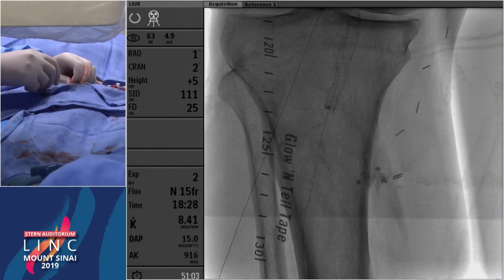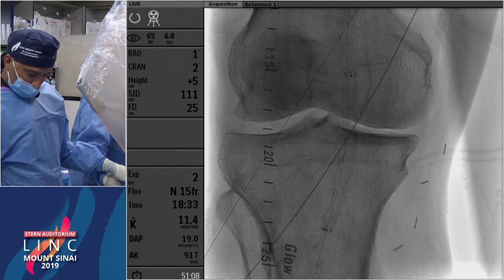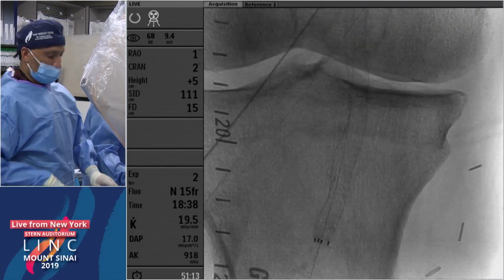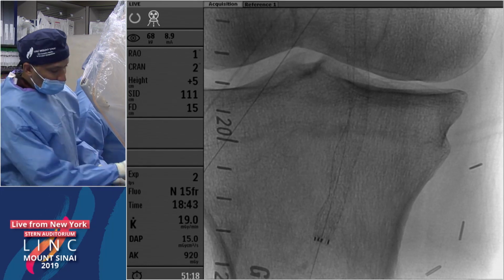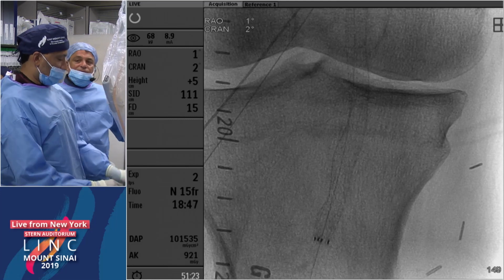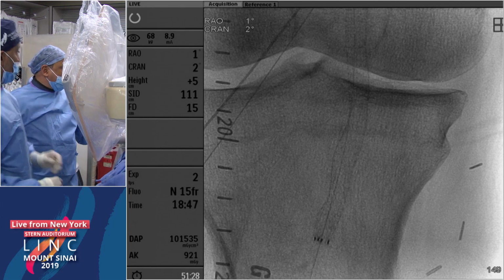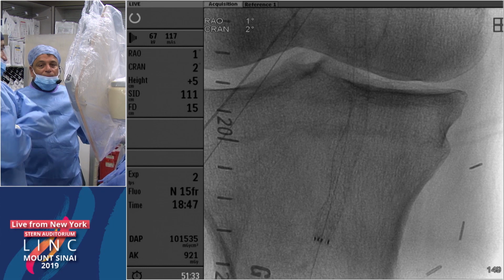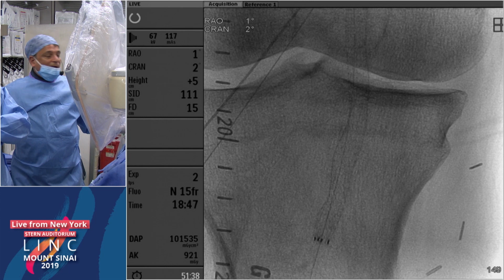So what we had to do, I just want you to look at how this Viabahn looks. Please, on the Viabahn for everybody. So you can see how the Viabahn is outpouched right at the level of the perforation, and I think that's the spot where we perfed. And now that we've covered it, we put a 6.0 by 7.5 centimeter Viabahn, and we ballooned it with a 6.0 balloon. We'll IVUS it to make sure, but it definitely looks like it was expanded. The IVUS measurement of the vessel prior was 5.7 or 5.6, right? So therefore, I think we sized it well with a Viabahn.